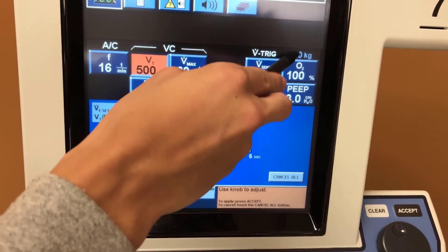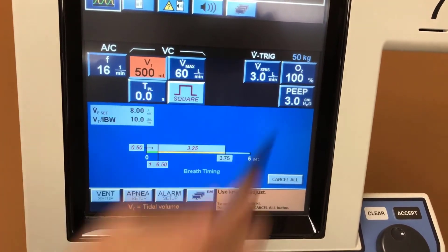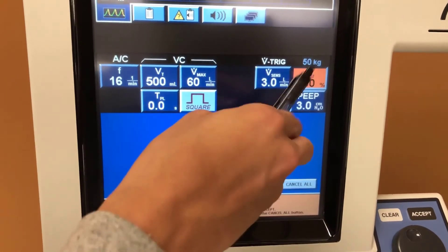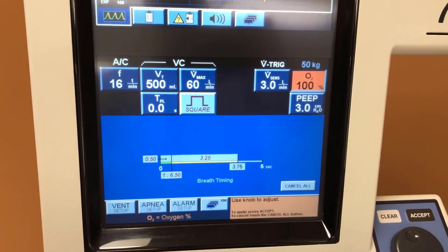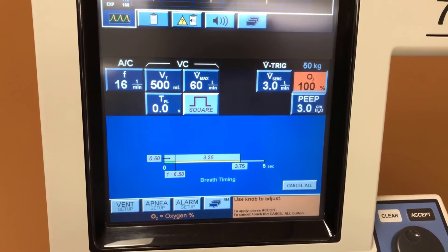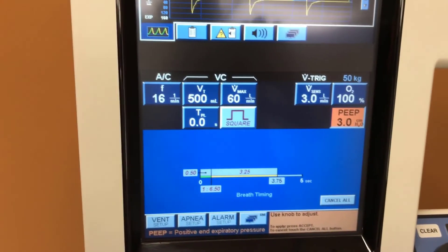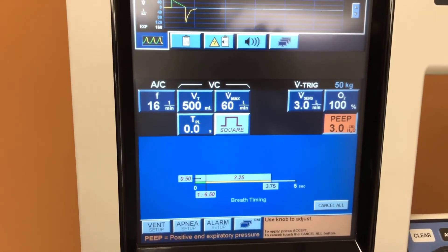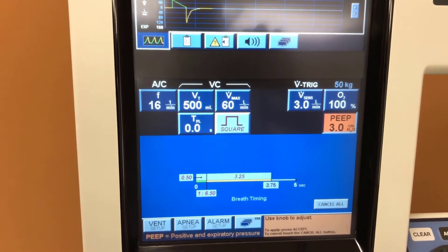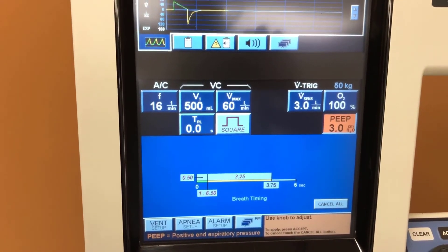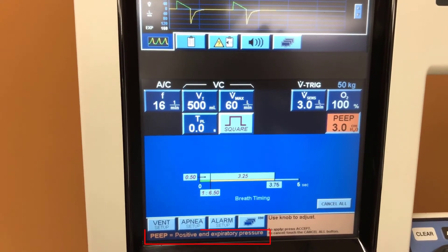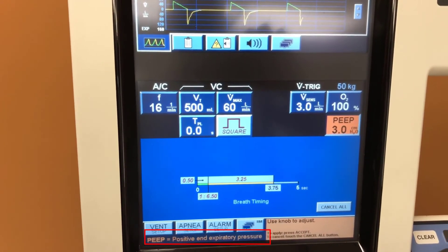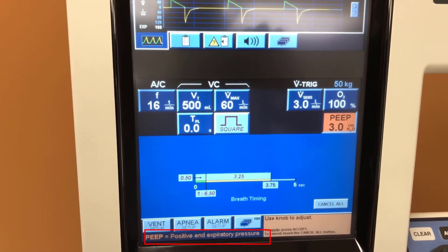Up here we have the patient's ideal body weight. Over here we have the concentration of oxygen being delivered. And over here we have the PEEP number — PEEP stands for positive end-expiratory pressure. We've set this at three centimeters of water of pressure.